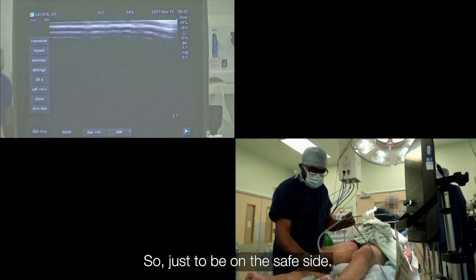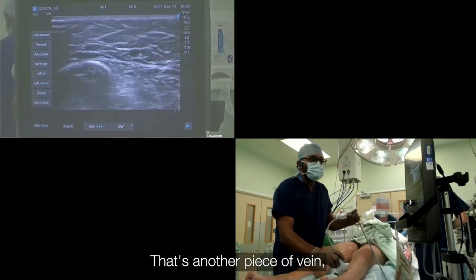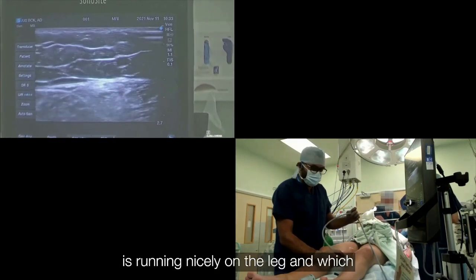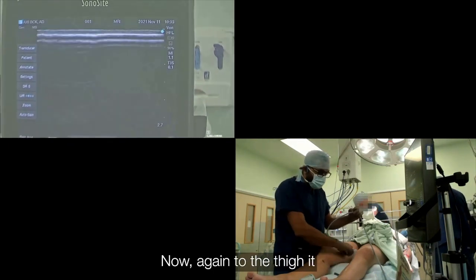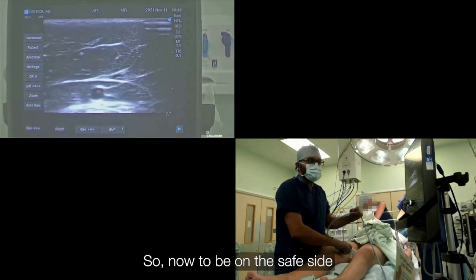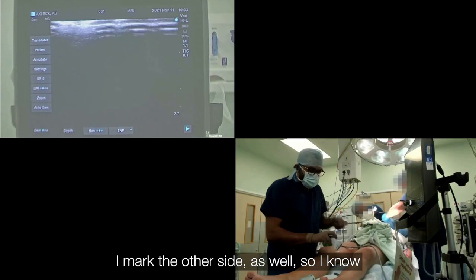Just to be on the safe side, a quick glance on the other leg. That's the other piece of vein, which is going in here. It's again a clean vein, running nicely on the leg, which is not as deep as the last one. Going deeper toward the thigh — very, very good vein. So to be on the safe side, I mark the other side as well.